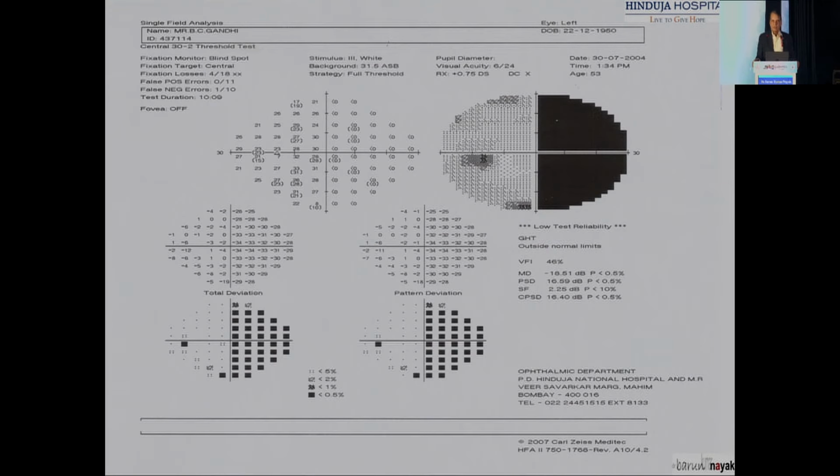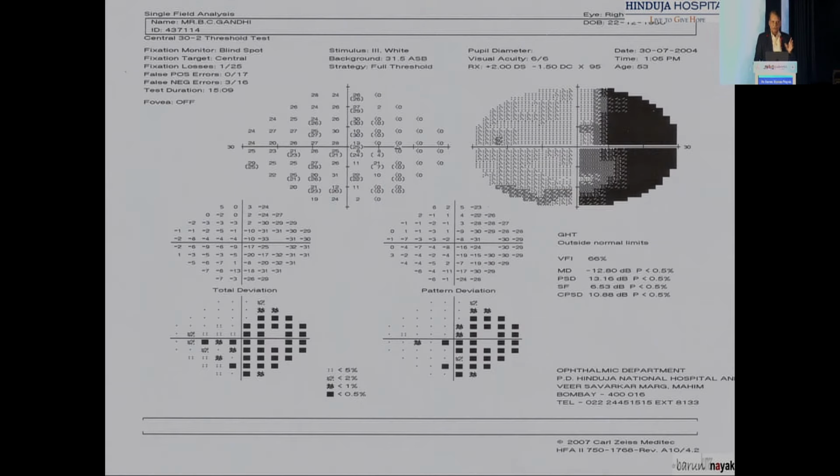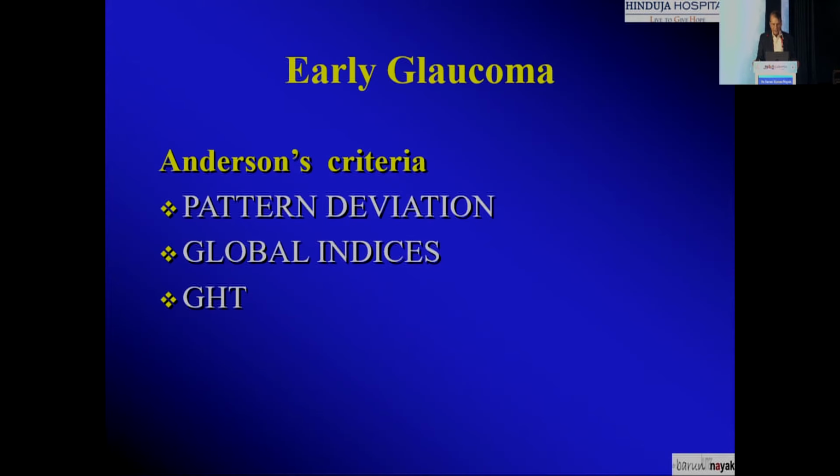Now whenever you see this, always see both the fields together, also for the hemianopic defect. Don't just interpret that the patient sitting in front of you is always glaucomatous; maybe they have some different disease.